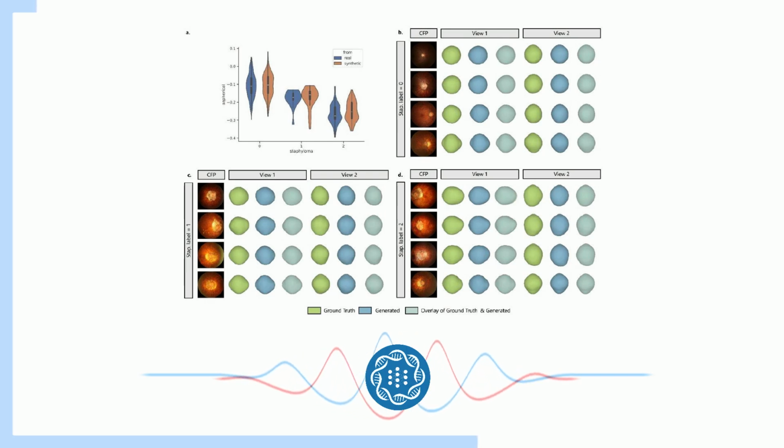And that guides the model as it goes through each of those denoising steps, ultimately creating that 3D eye that accurately reflects that individual's eye characteristics.